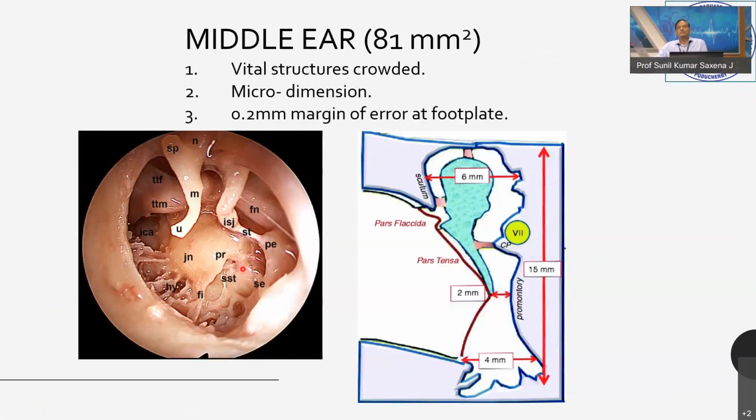That is fustis. This is the funiculus, and fustis goes towards the round window. The other thing is that the round window membrane is always perpendicular to the footplate of the stapes, so it will always be close to the footplate. In case fustis is present, that also helps you to identify it.